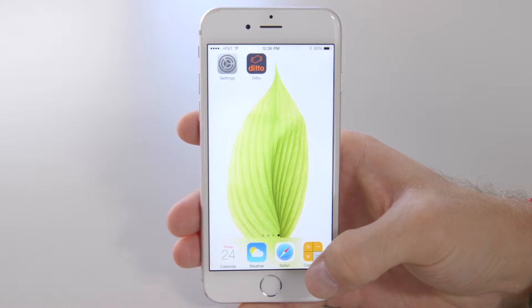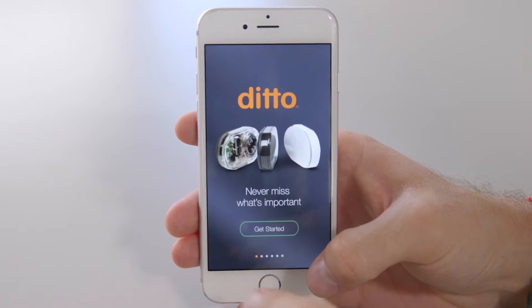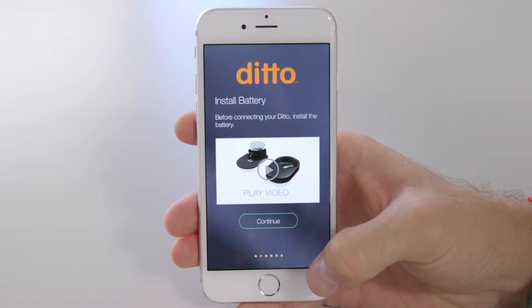I'm going to show you how to pair Ditto with your iPhone. To get started, let's launch the app. Page 2 of the app will show you how to install your Ditto battery.